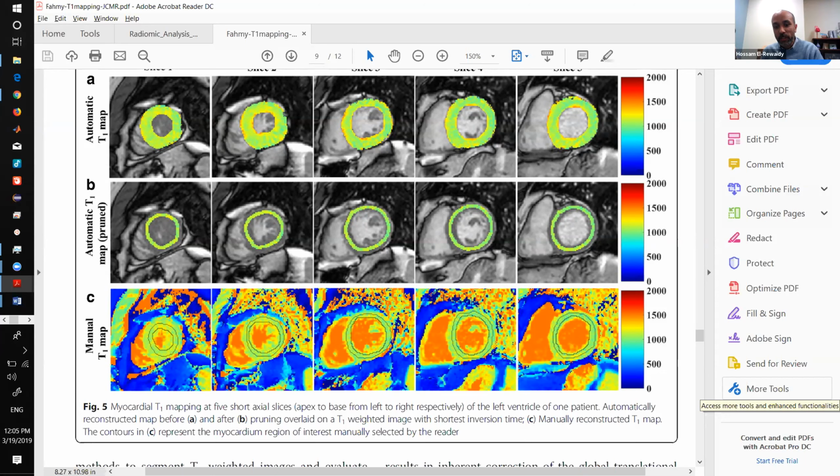The state of the art now is to use it for segmentation. It performs very well. So at least at the current stage, I think segmentation and then using segmentation-based registration is the optimal way of doing it. Doing it for registration probably needs a lot of future research. Okay, thank you very much.